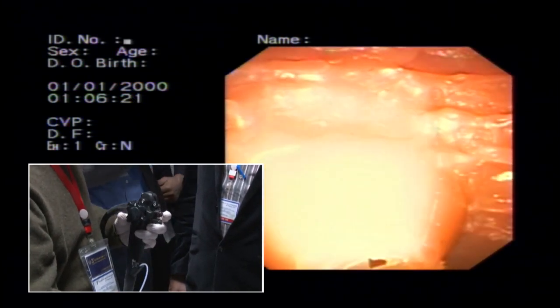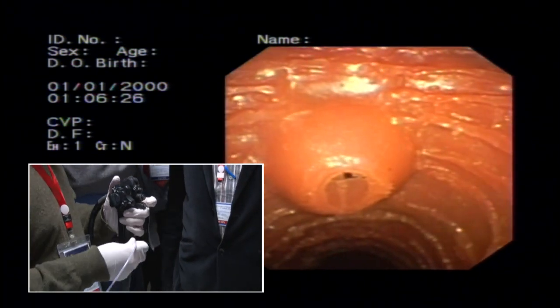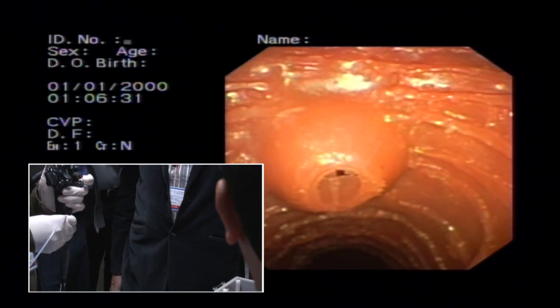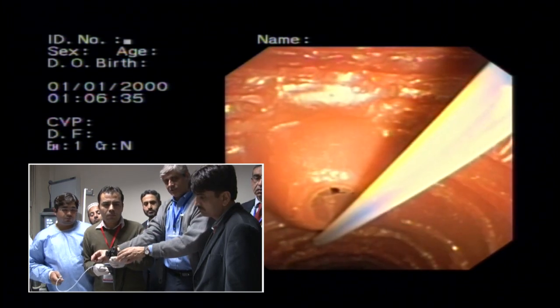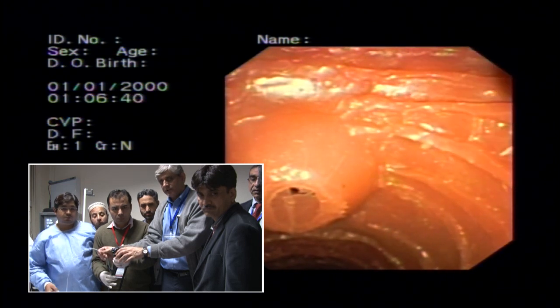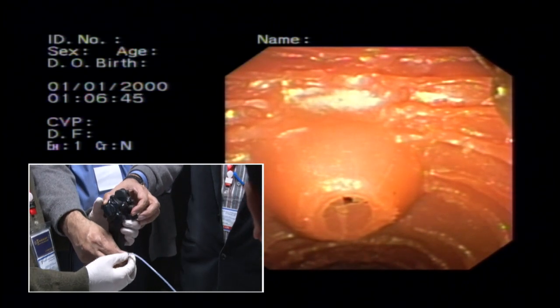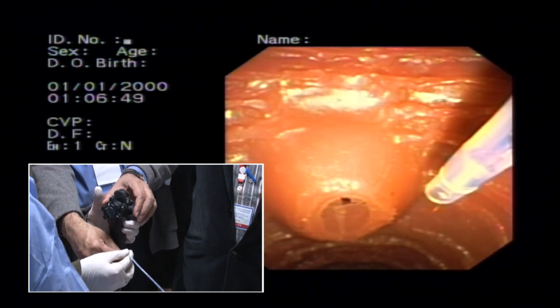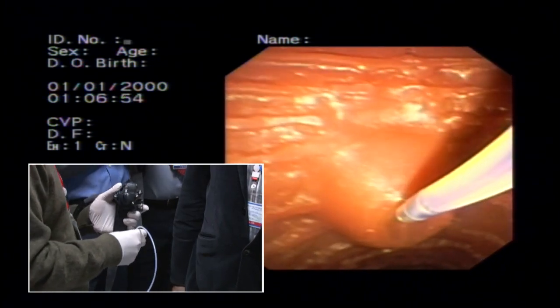Okay, you can do 2 ways. I think we just want to go straight. Otherwise, you can actually put a cannula, put a wire, and then load everything. But see if you can do it like this, and we load. I think one of the points Vakar made, which is very valid, is what you just did. देखो इसको जब आप pull back करोगे, ठीक है, ये अंदर आ गया. अब अपने एलिवेटर को दबा दो, ठीक है, लॉक हो गया. अब ये जब ये आएगा तो ये नॉक कर रहा है. जब नॉक करेगा तो आप इसको थोड़ा सा उठाओगे, इसको अंदर डालोगे. अब इसको आप उठाओगे. जैसे वकार साहब ने कहा कि जेजिनम में चला गया.